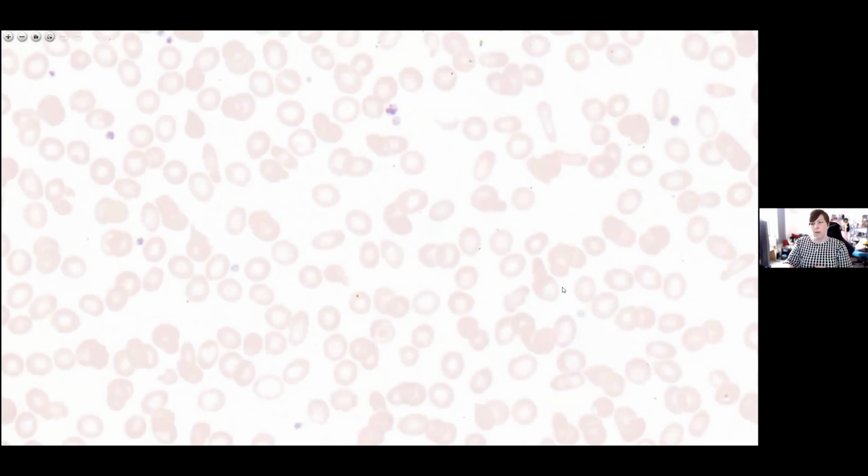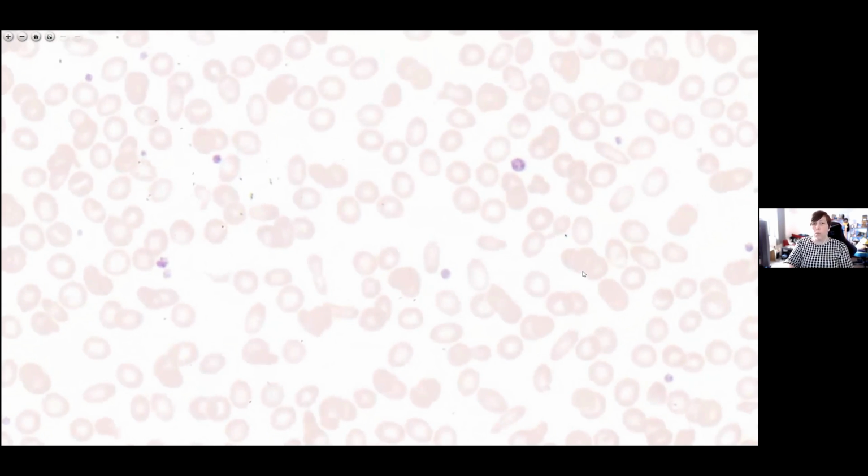If it's a hemoglobinopathy or a thalassemia trait, you don't often see basophilic stippling. You can definitely see it in hemoglobinopathies, in beta thalassemia especially, and where there is compound heterozygosity, where they've inherited multiple mutations. In my experience, most of the basophilic stippling is quite fine.